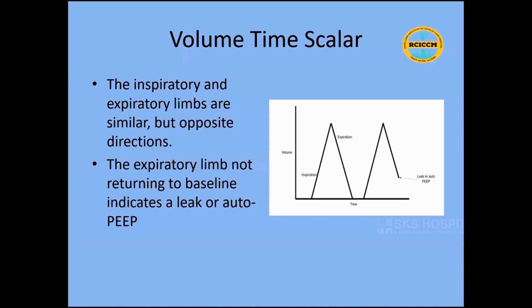They can tell us quite a lot of things, just like the ECG of a cardiac patient tells you quite a few details. Anybody on a mechanical ventilator, we should be looking at these graphs, as they can tell you a lot of information about the patient.